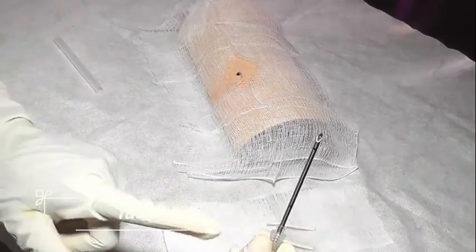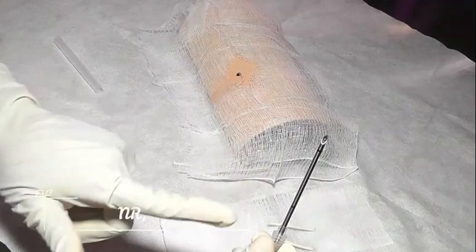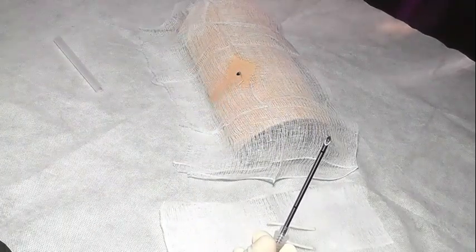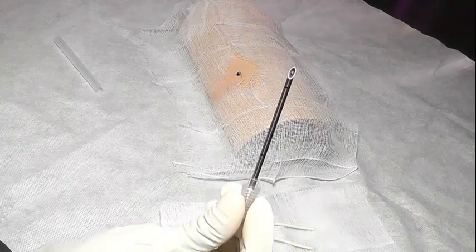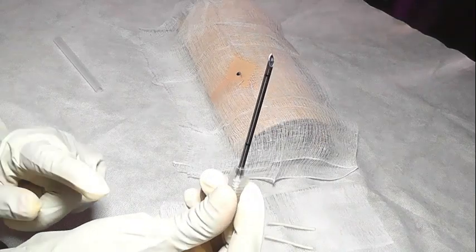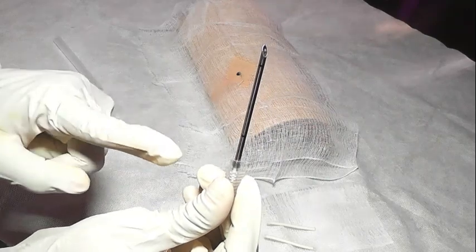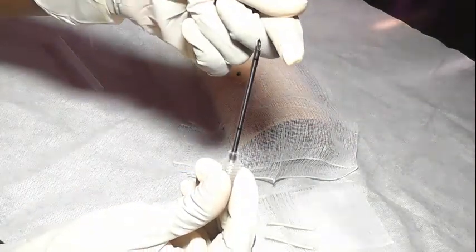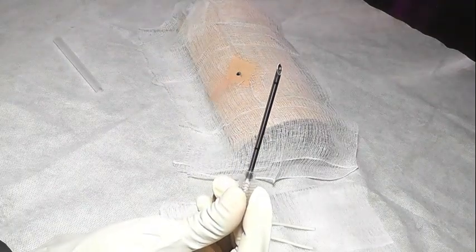So you don't touch the side of the introduction with your hand, or the portion that you're going to introduce into the arm. You don't touch it with your finger. You can see that it has 2 marks. There's a mark that is very close to the handle, and then there's another one that is close to the tip of the trocar.